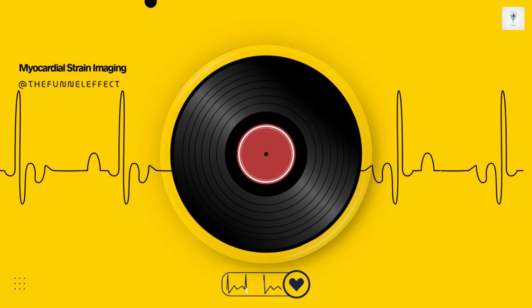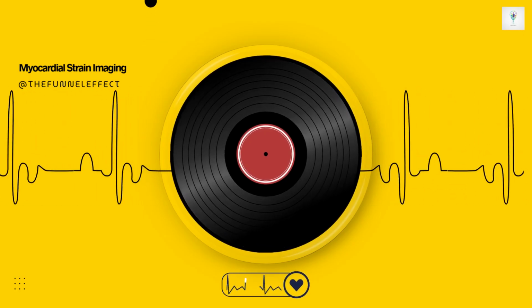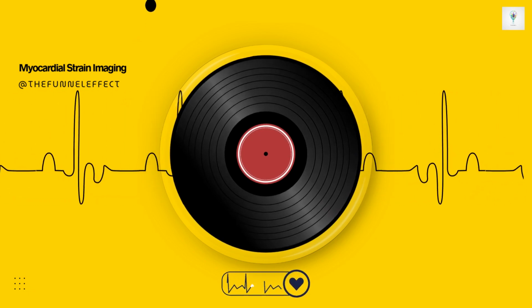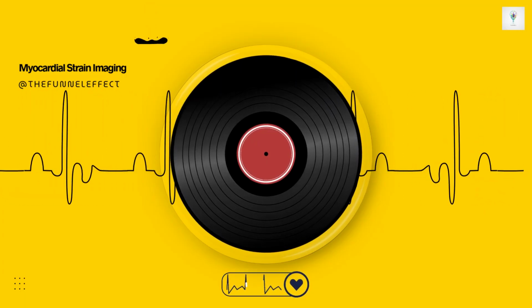Potentially, yes. Historical data showed GLS differences could be up to 3.7 percentage points between vendors. If you're looking for that critical 15% relative drop that signifies cardiotoxicity, switching vendors could completely mask it or even create a false positive. Standardization is still a major, major challenge.